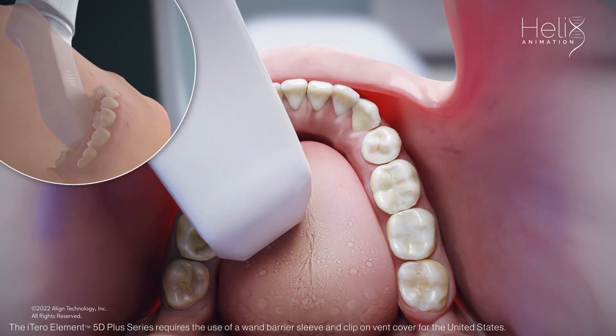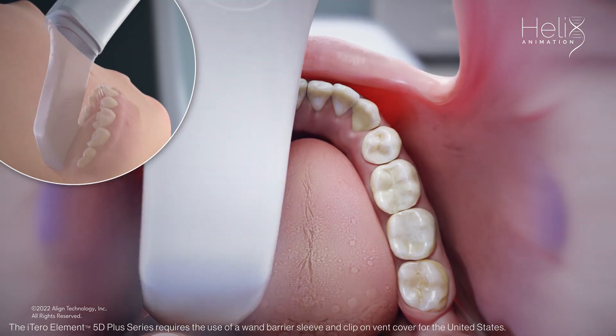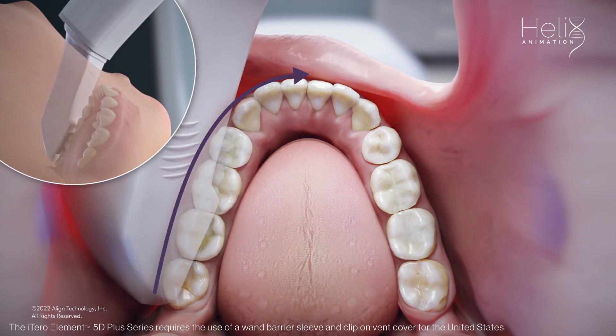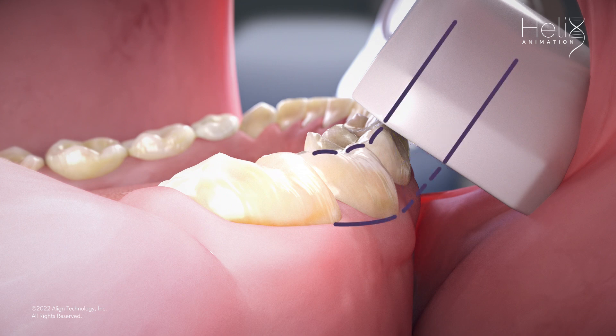Twist to capture the interproximal anatomy while you scan. When you have completed the lingual, rotate to the buccal and use a rocking motion as you move towards the anterior to capture the interproximal anatomy of the buccal. Place the sleeve at a 45-degree angle to ensure that you capture some of the occlusal as you scan the buccal.